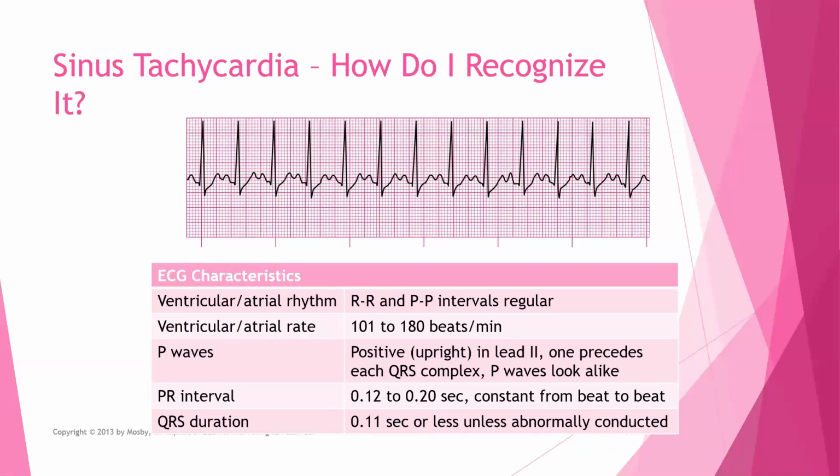Remember, we've got 300, 150, 100. I know it's between 100 and 150. But how do I know how far it is? Well, if you look at those little boxes, there's 5 little boxes between those 2 heavy lines. The difference between 100 and 150 is 50. So each one of those little boxes is worth 10. So remember, there's 5 boxes that make up the difference between 100 and 150 when we're doing that sequential method. So each little box is 10. Now, if we were doing different rates, those little boxes would be worth different amounts, but here it's going to be worth 10 in this segment.